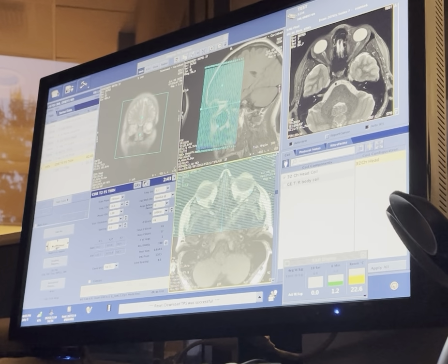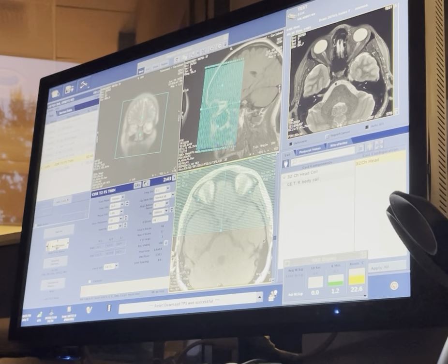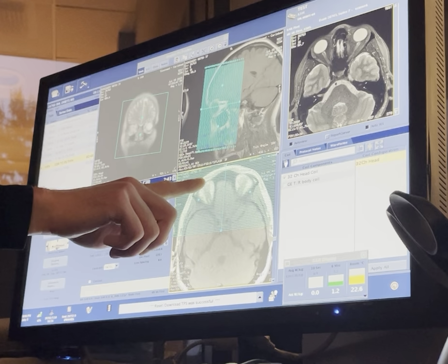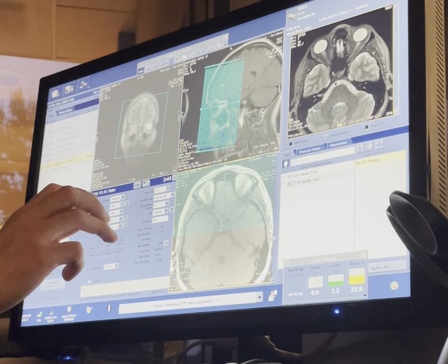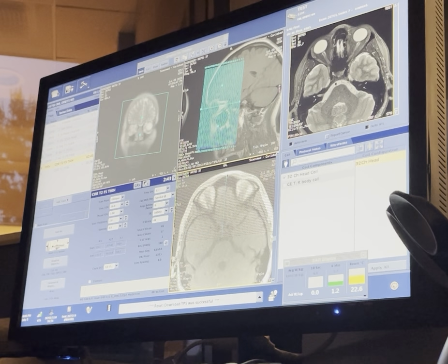Okay, so right all the way down, all the way down. I would say right there. Keep going, keep going. It's still going up. I'd go right there. So probably cut down to like right here, give or take. Right click, and hold. Go up. Yeah, there you go. Now drag them down. Till, yeah, let's try that. Now let's scroll up.